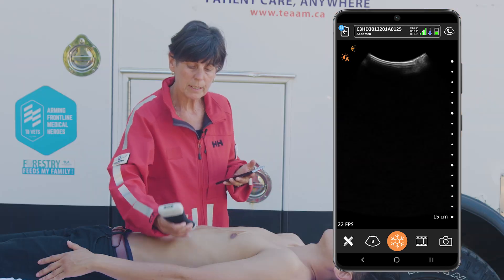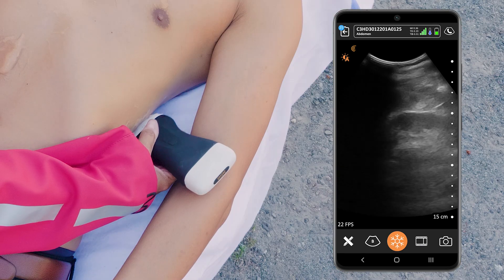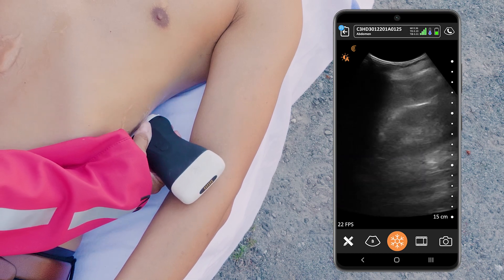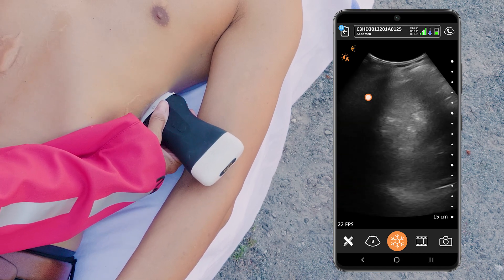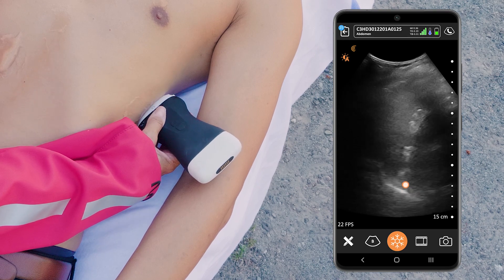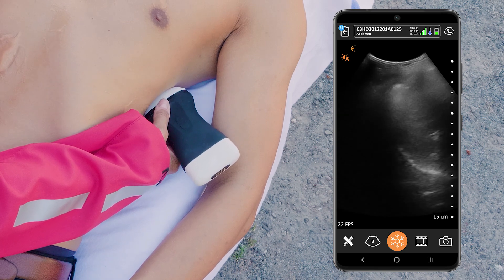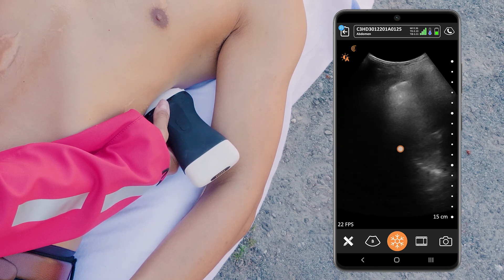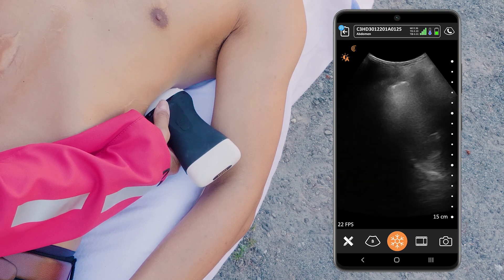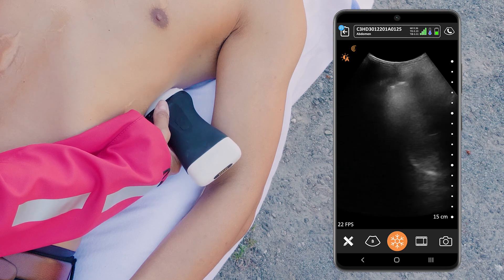From here we can move over to the left side and do the same thing. I'm going to look for free fluid in the region of the left kidney and the spleen. Then I'll move up a little bit higher to the left hemidiaphragm — that nice bright white curved line — and look for any fluid in the dependent portion of that pleural cavity as well, with a quick sweep back and forth.